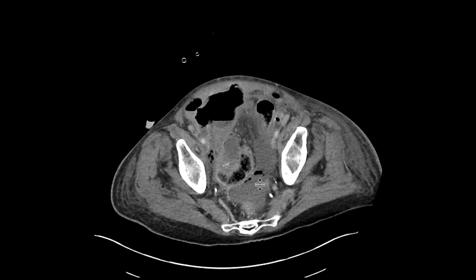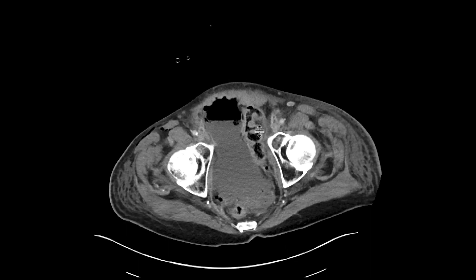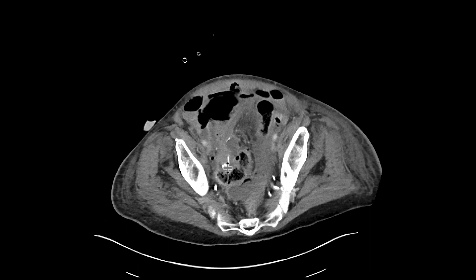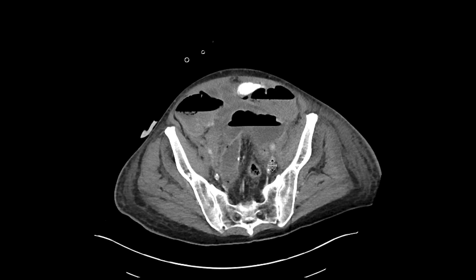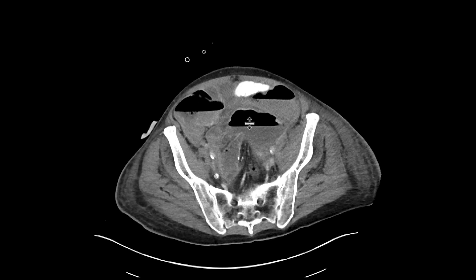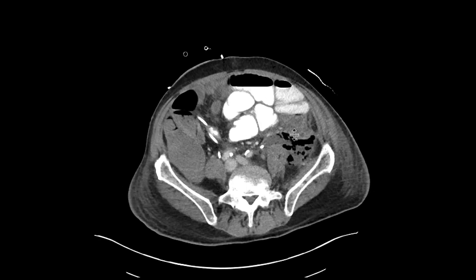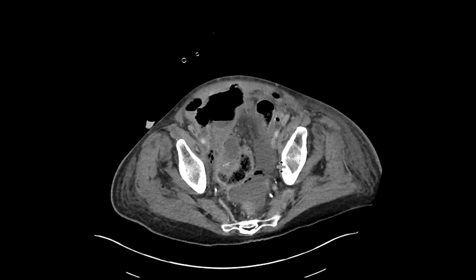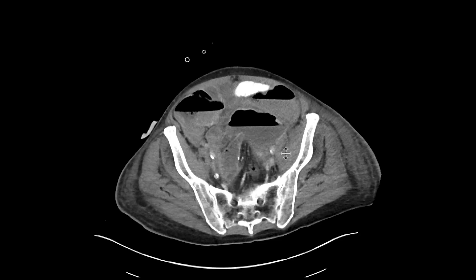We can see it over here, going upwards, also looping downwards again. As we go up to the anastomotic site, you can see that there's all this fluid that's sort of pouring out of that region and filling up these collections in the pelvis. And these collections are all communicating with one another.